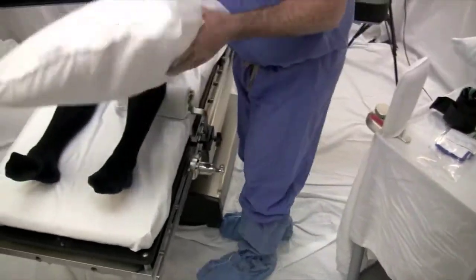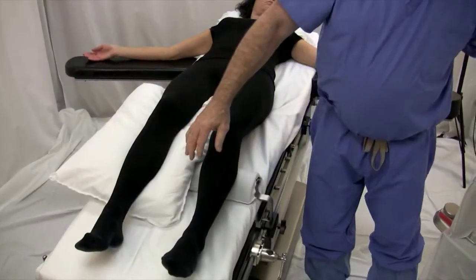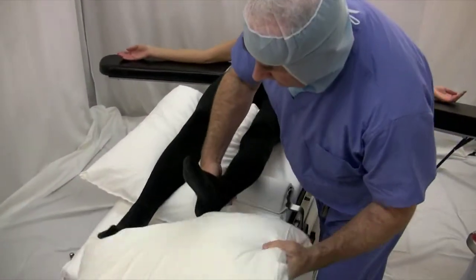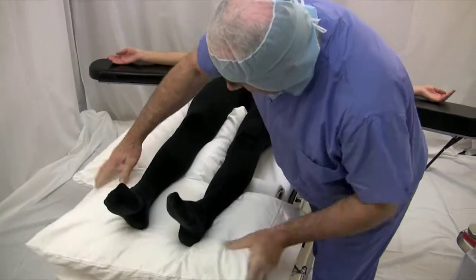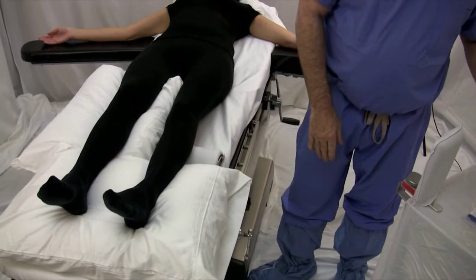I then place a pillow underneath the well leg and then one under both heels so that when the knee is straight, it's not resting on the foot support.